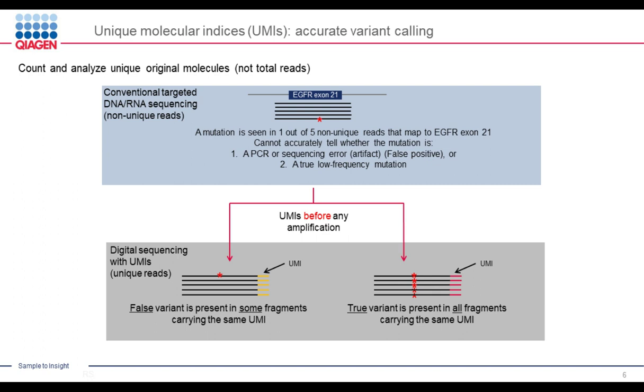If this was a true low-frequency mutation, you should see the variant in all of those fragments that carry the same unique molecular index, as you see on the right-hand side. So by incorporating unique molecular indices, we now have an approach to discriminate between what is a true low-frequency mutation and what is a PCR error.